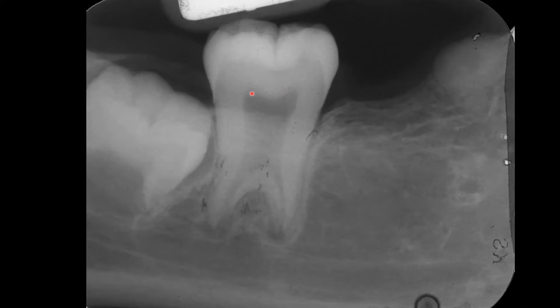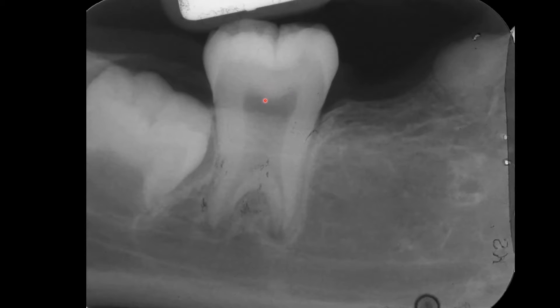How about the pulp chamber? It's also almost to the middle third of the root. We know that a normal pulp chamber is usually inside the crown. One more finding — how about the constriction of the CEJ? There is none.